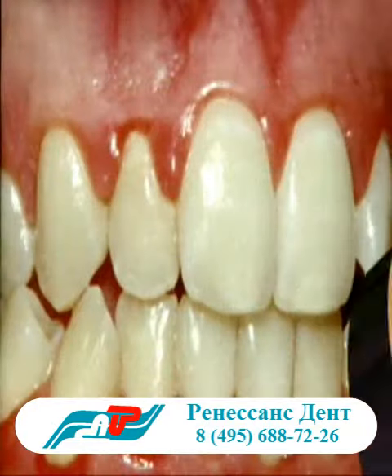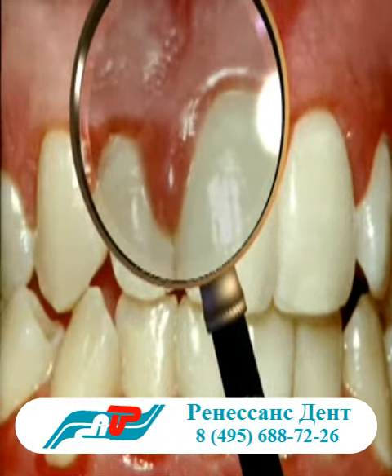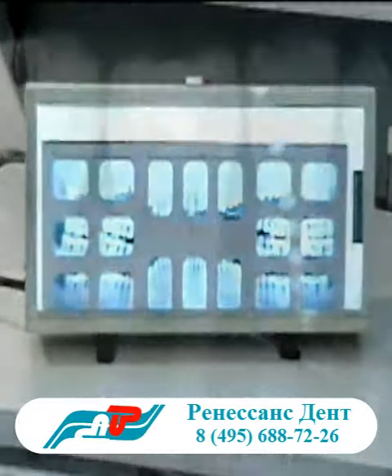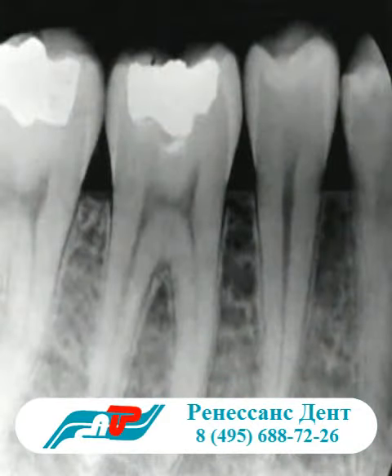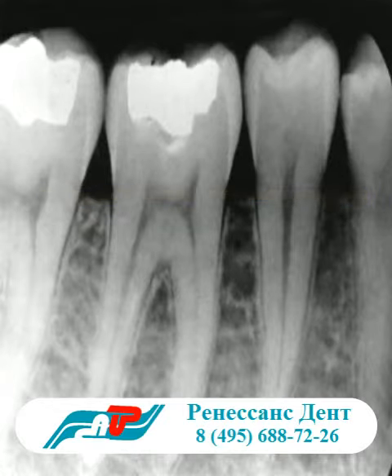Look especially close at the difference of the gums between the teeth. This is where periodontal disease usually starts. X-rays tell us a lot about periodontal disease. This is a healthy mouth. The bone comes up high around the necks of the teeth, and it's even throughout the mouth.